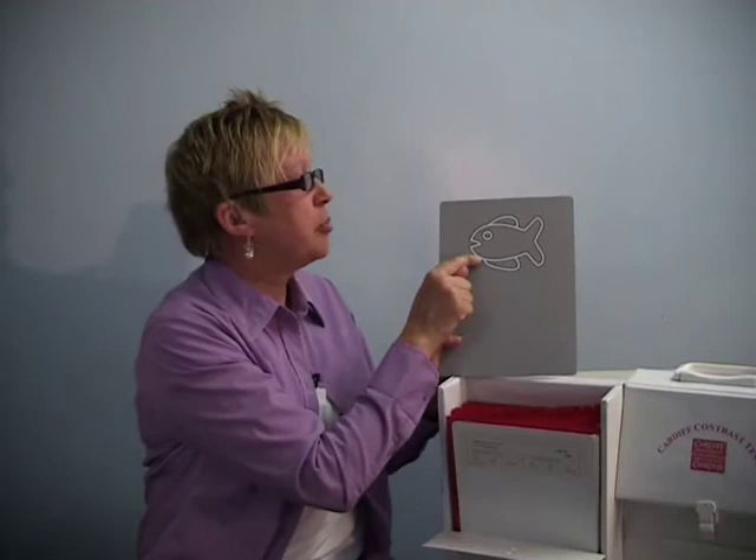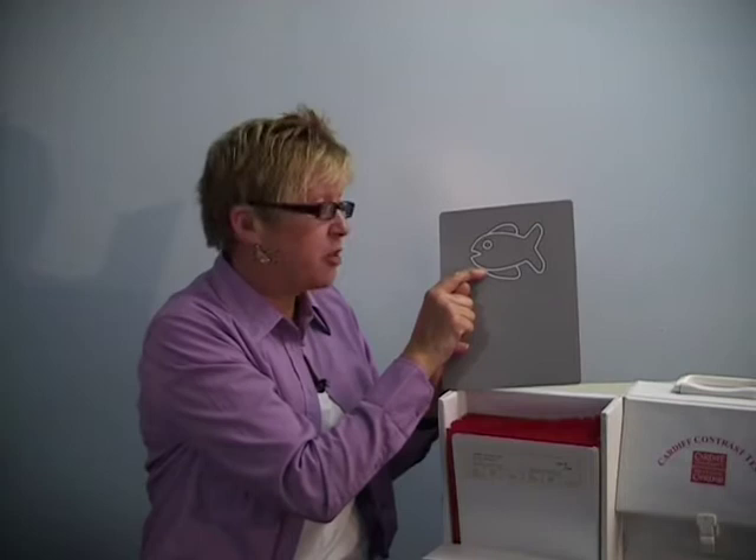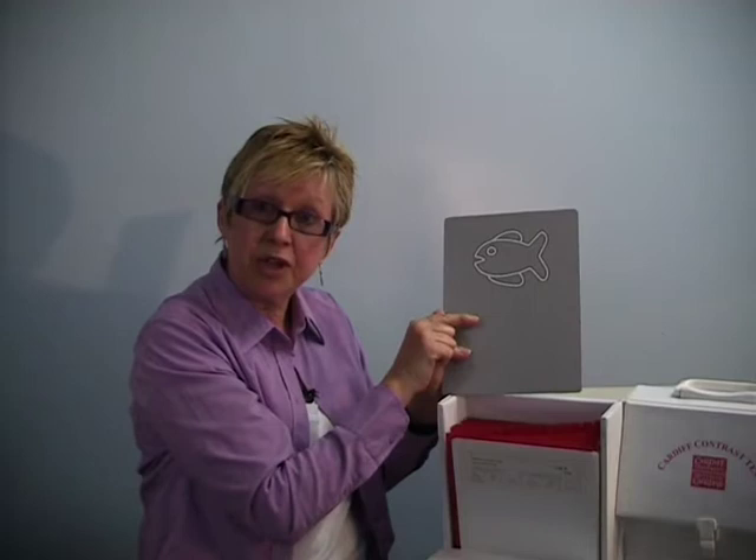Each card has a picture placed either at the top or the bottom of the card, with the other half of the card blank. If the patient can see the picture, they will want to look at it, and we can watch the patient's eye movements to tell us whether they can see it. Each picture is made up of black and white outline — in the acuity test, the brightness of the black and white on average is exactly the same as the grey background.